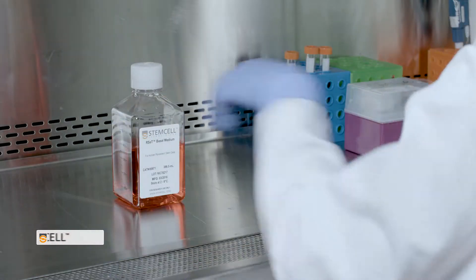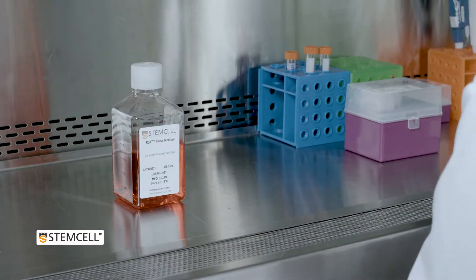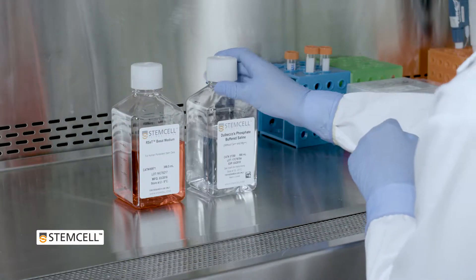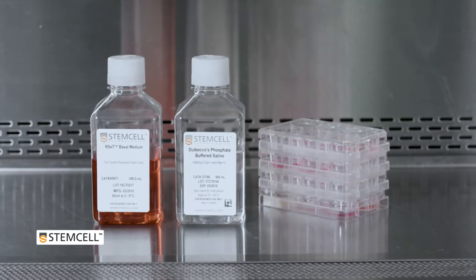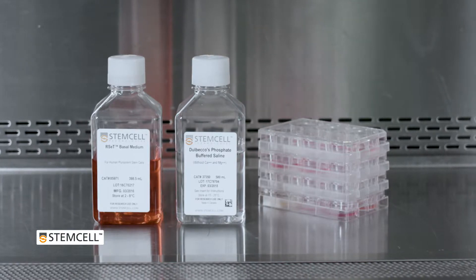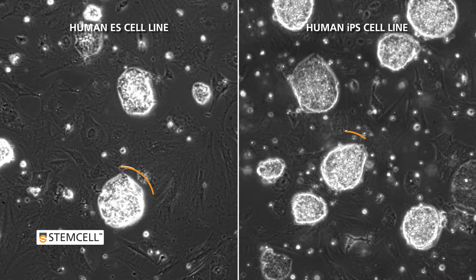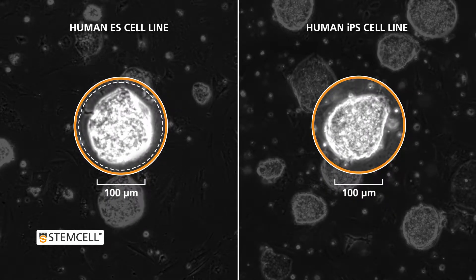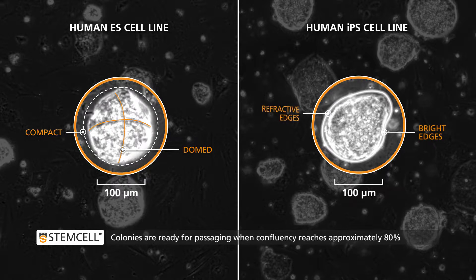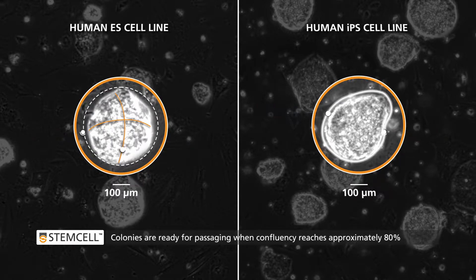Let us guide you through the protocol for passaging human naive-like PSCs derived and maintained in Reset. Naive-like PSC colonies exhibit a compact and domed morphology with bright, refractive edges. When confluency reaches about 80%, the colonies are ready to be passaged.